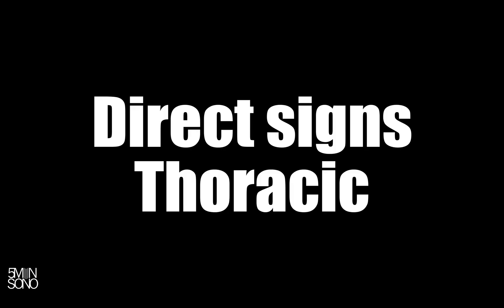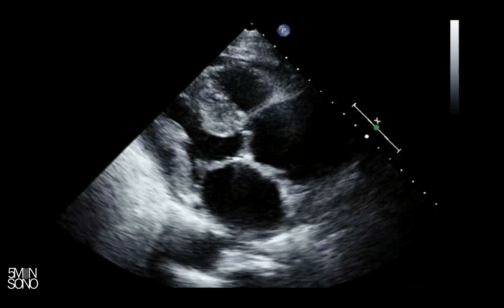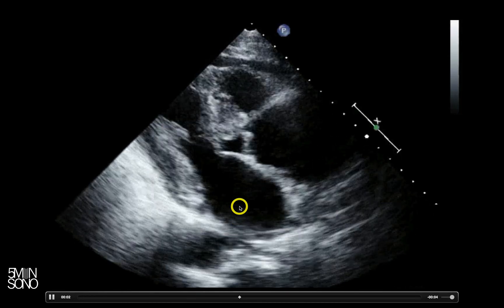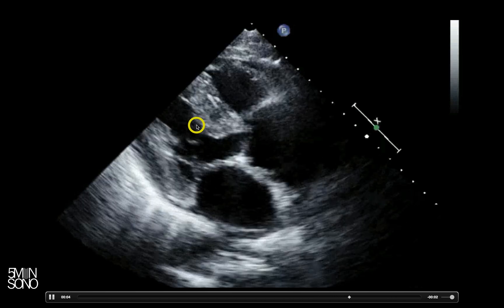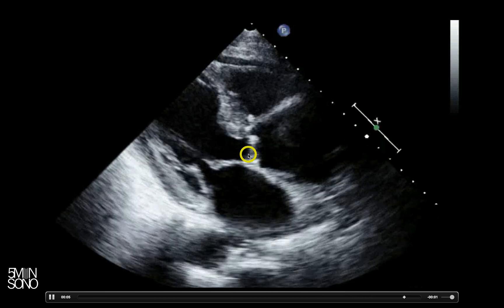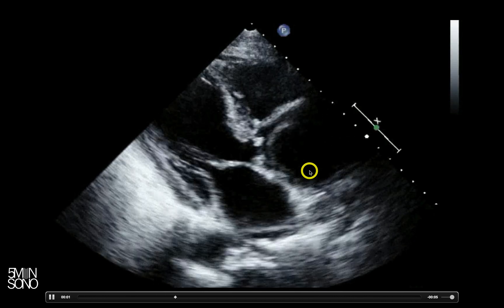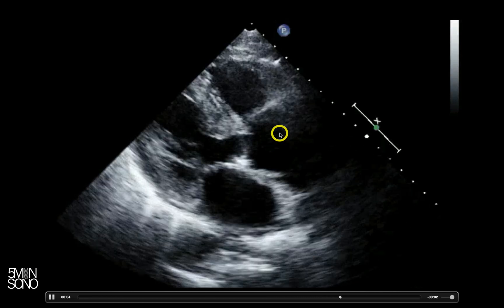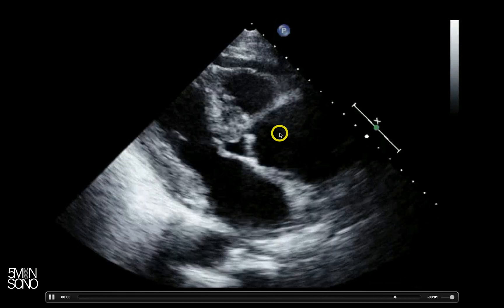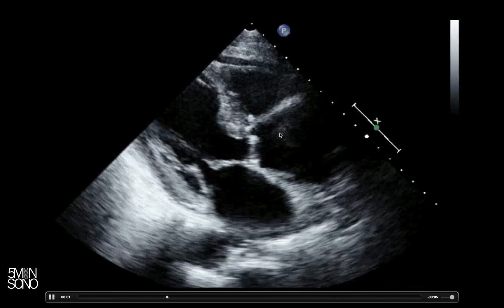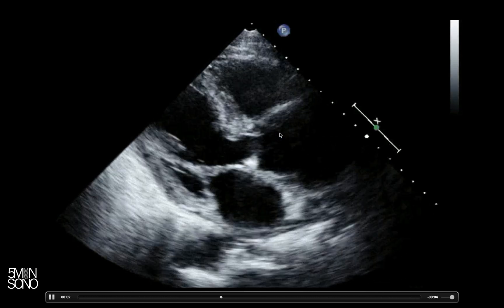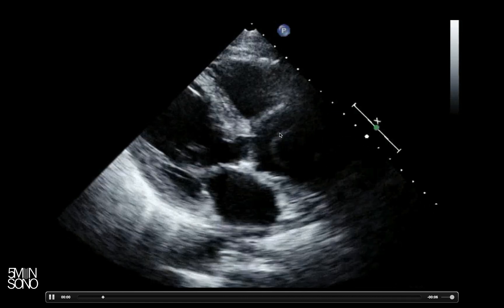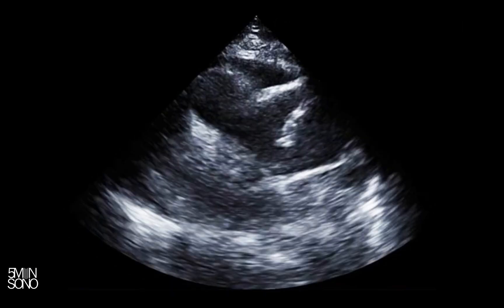Let's talk more about the direct signs of a thoracic aortic dissection. Here is a pretty obvious one: left atrium, mitral valve, left ventricle, aortic valve, and a really dilated ascending aorta. You can even see a little flappy thing in there. The aorta should never have a valve or anything flapping inside of it. If you see anything that looks like it's flapping inside the aorta, that is a dissection.